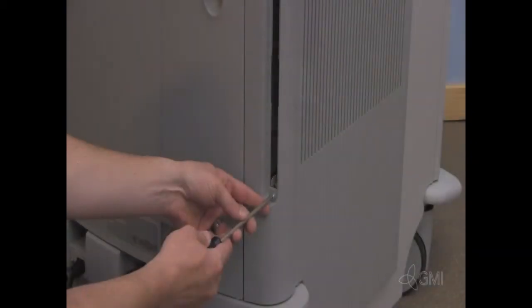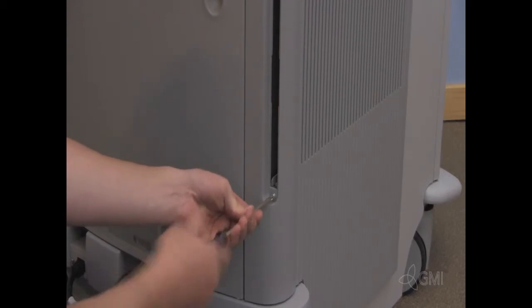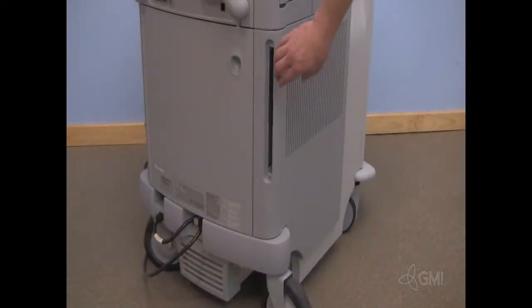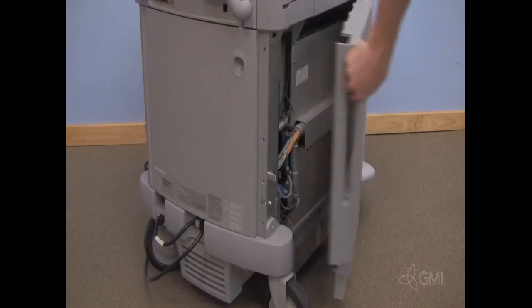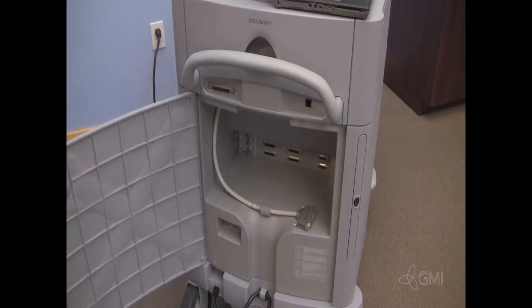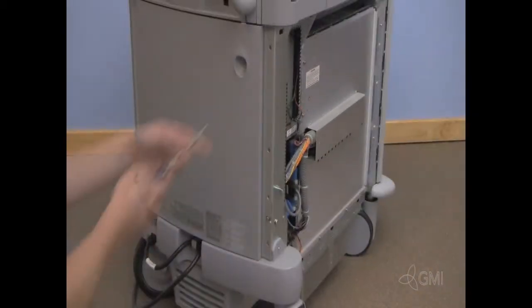Locate the screw and remove it. Pull out and remove the left cosmetic panel. Open the rear door. Remove the 6 screws from the rear panel cover.